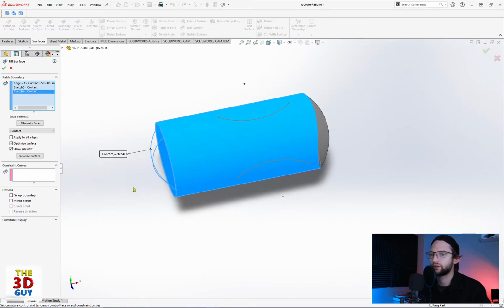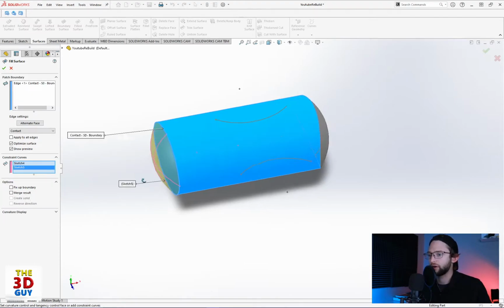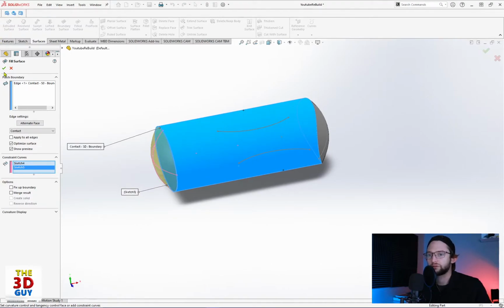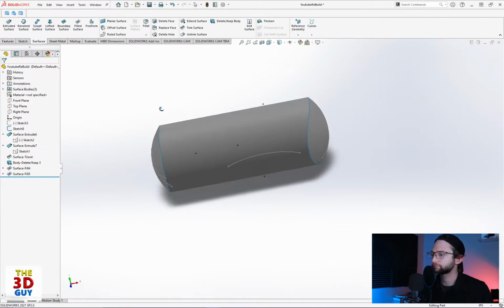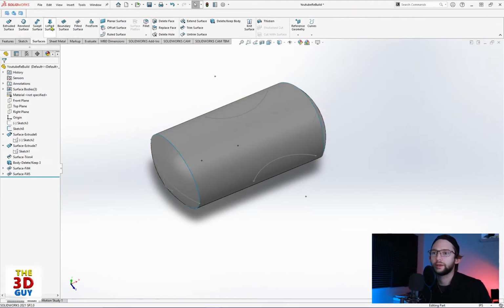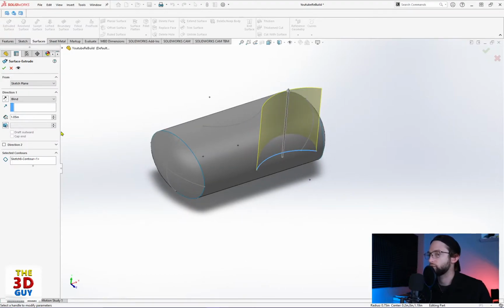Yeah, so if you see right there, if we hit the boundary patches, it's not working the same way. I'm not quite sure why it does that. So we're just actually going to delete these two, and we should be able to put them in as a constraint curve, and there we go, it fills in. So if it doesn't work one way, definitely try it the other. So we have that basic shape already, definitely coming together. And we're actually going to extrude cut these one at a time. It won't really like us doing it two at a time.